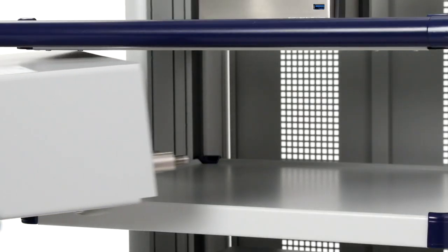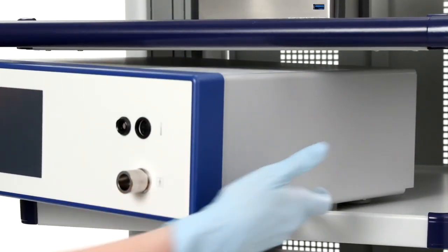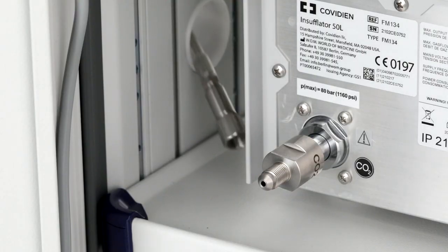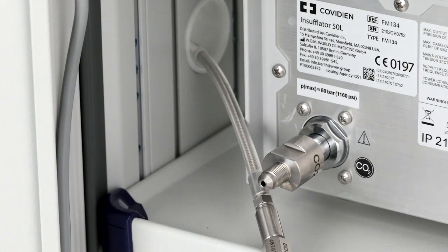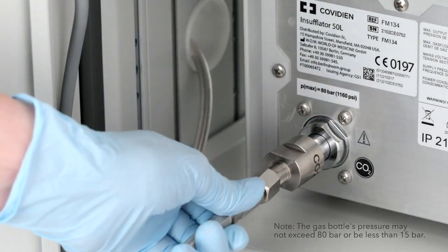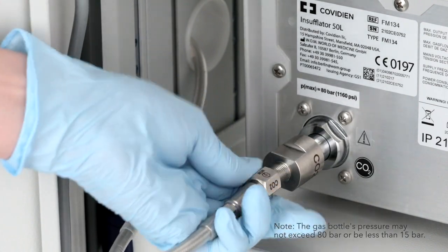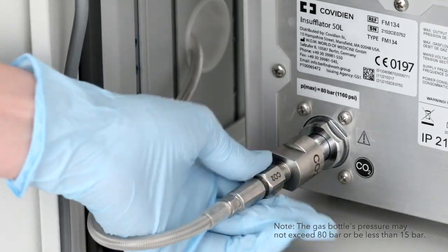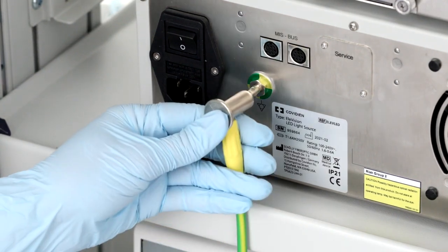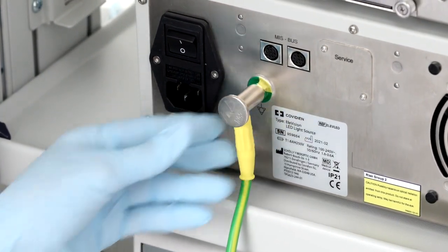Next, place the insufflator on the cart. To connect the insufflator to the CO2 tank or central gas supply, use a high-pressure tube. Fix the high-pressure tube to the rear gas inlet connection with the nut and tighten. Connect the potential equalization connectors on the rear of the devices.